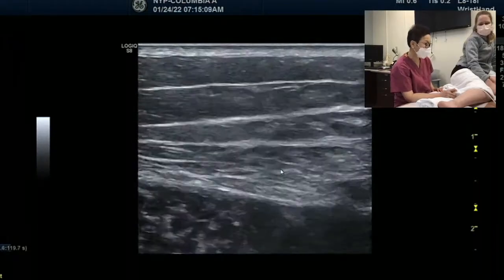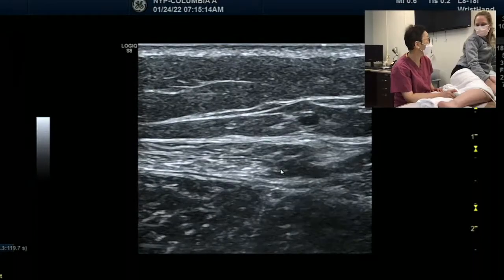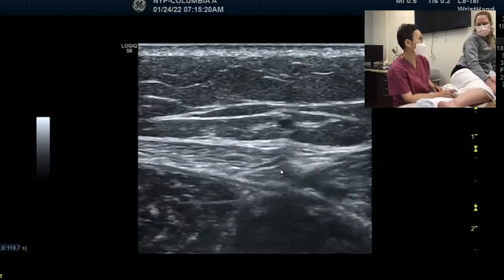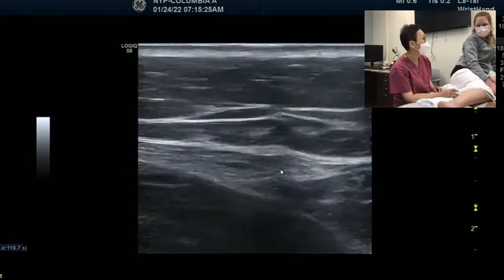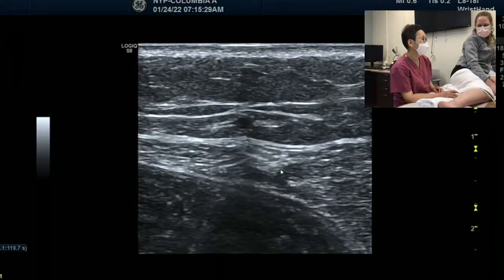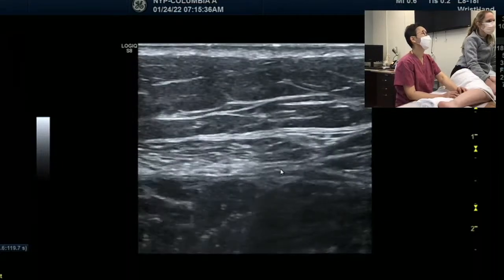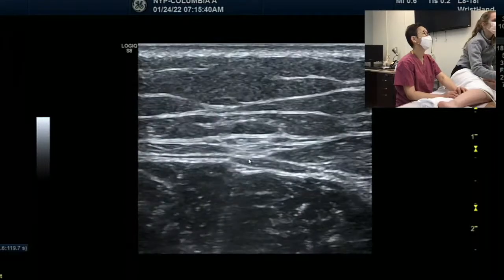So the funny thing is now when I do injections, if I have to go to the middle to look for the flexor hallucis longus, or if for whatever reason I have to go to the middle part of the calf, I try not to touch the sural nerve. That makes sense. Once I studied ultrasound, my way of injecting changed a little bit, but not to cause a problem. So the sural nerve sits over there, see two. One in the middle. Here, two.